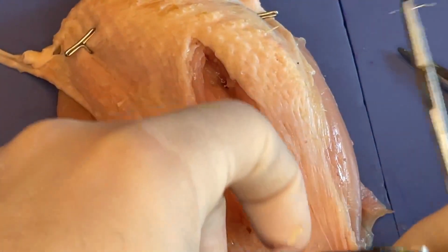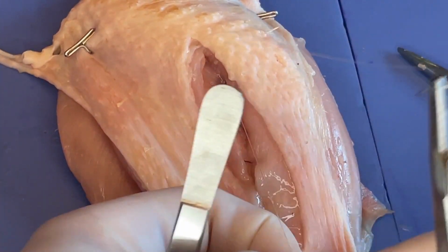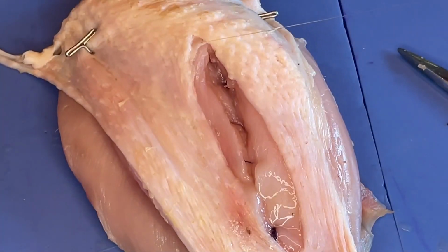Sorry, I'm getting my thread wrapped around my tissue here. This is where it pays to have a good assistant.